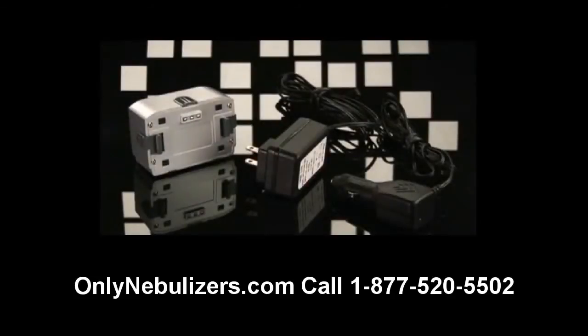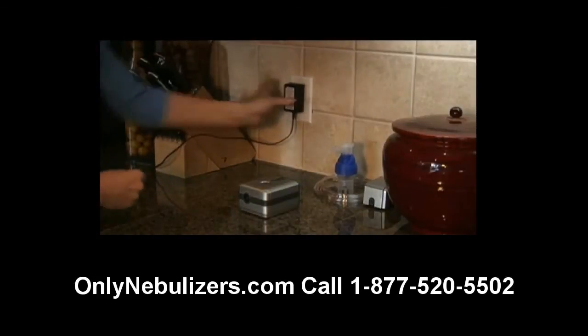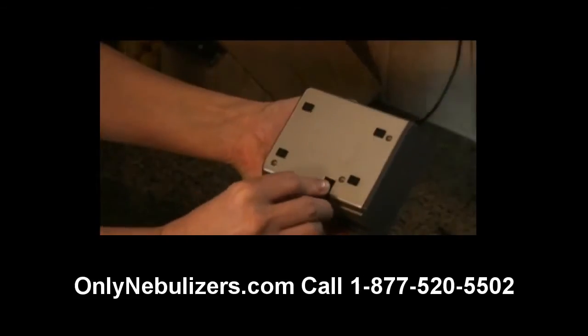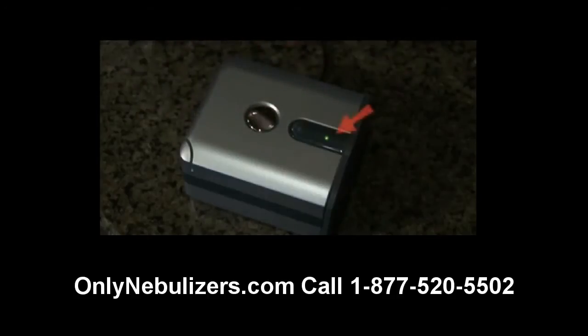Your DeVilbiss Traveler can be powered in several different ways for your convenience. To use your Traveler with a standard power outlet, simply insert the AC adapter into an appropriate wall outlet and then insert the opposite end of the power cord into the power socket of the Traveler. The power indicator light will display green when the unit is turned on.